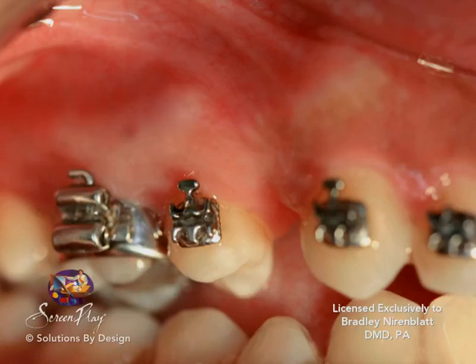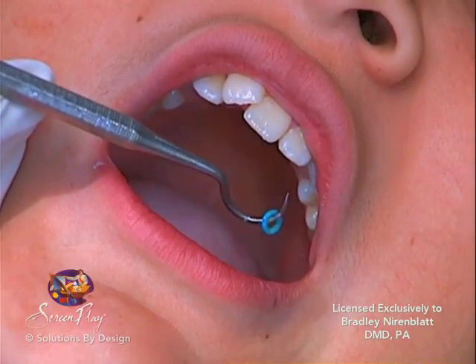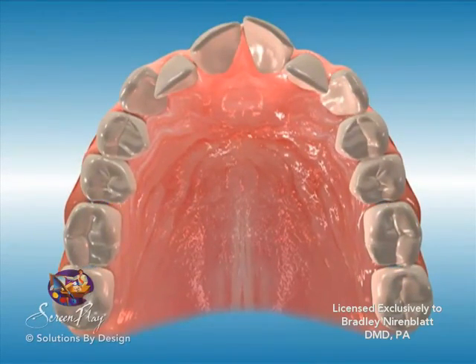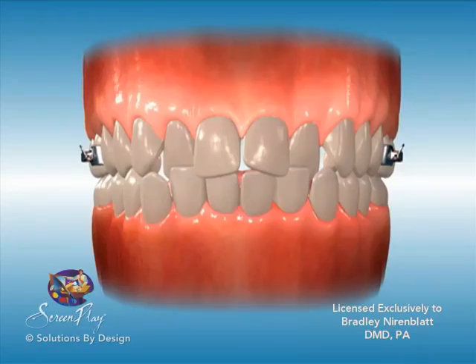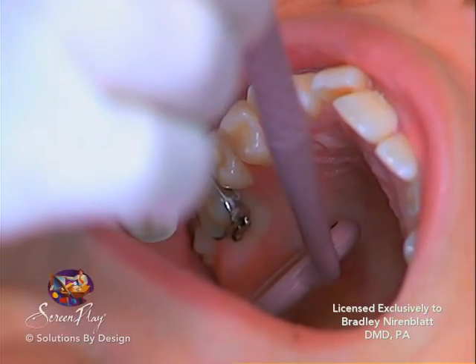If there is not enough space available, the space is created with spacers, which are small, flexible rings resembling small rubber bands. These spacers are placed between the molars to gently move the teeth to create the space necessary to slip the band over the tooth. This may take a few days to achieve. Once the proper space is achieved, the molar bands are fitted for size and seated into position.